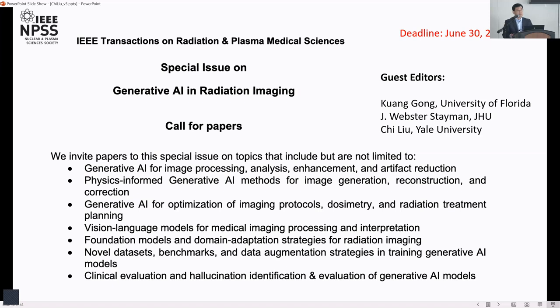Right, exactly. That's a great question, and that's exactly what we're doing right now. In one of the papers, we put that in the revision. If we can have some way to quantify hallucination, Qianzheng has some work and Mark has some work on that. If we can determine that with some metrics or quantification indexes, it's not only used to evaluate different approaches, but it could help us determine that some noise level is too low, regardless of what we do. It's just not feasible to give us the best image without hallucination. It could be like 20-30% of the counts or something. That could help us determine the threshold.